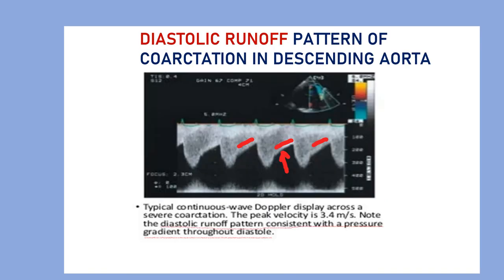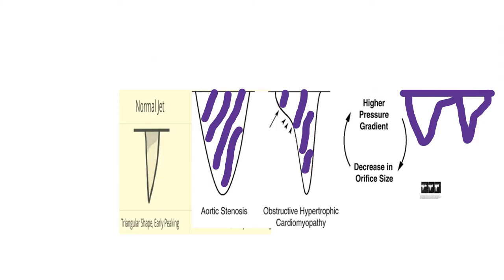Another distinct Doppler signal that we should diagnose at a glance is seen when performing CW Doppler of the descending aorta in the suprasternal window. The diastolic runoff seen here is very important because it is consistent with a pressure gradient throughout diastole, and this indicates severe coarctation of the aorta.